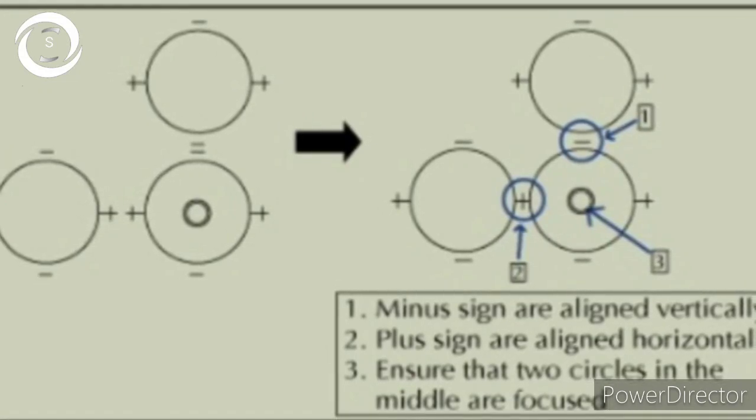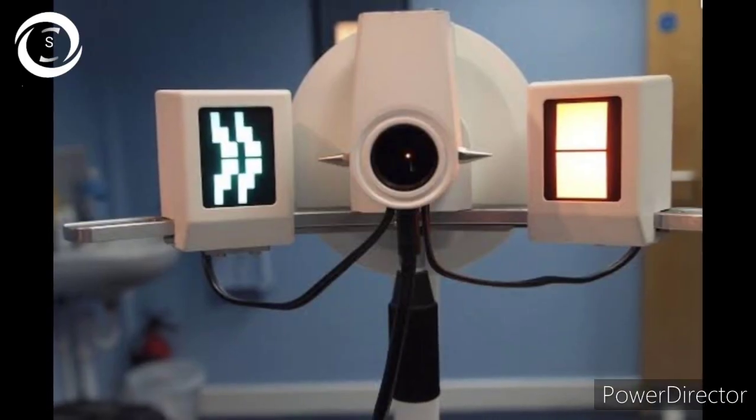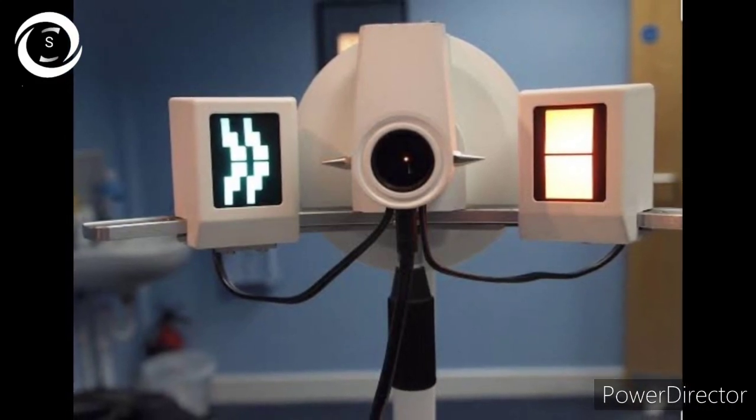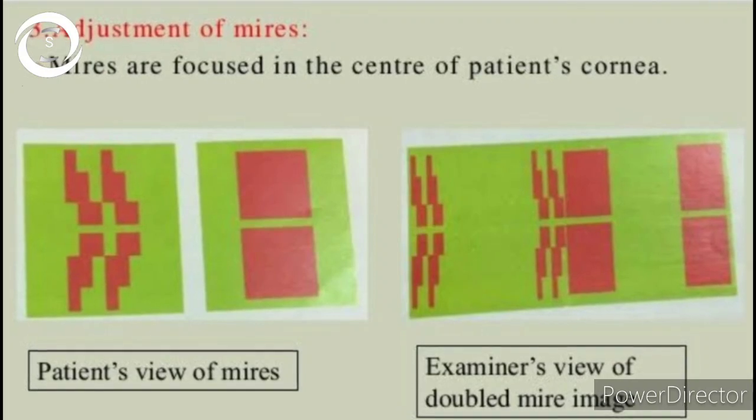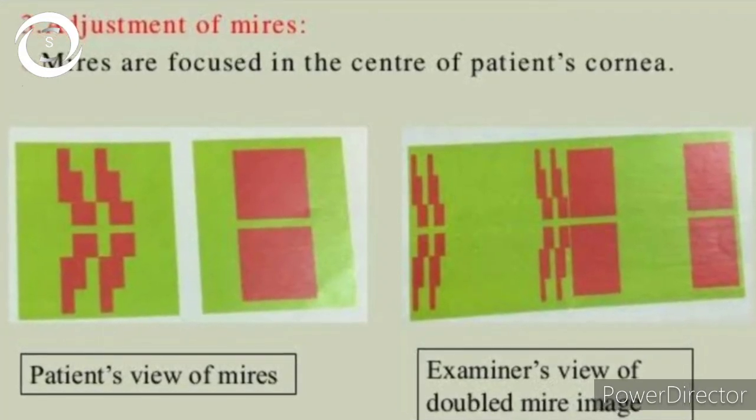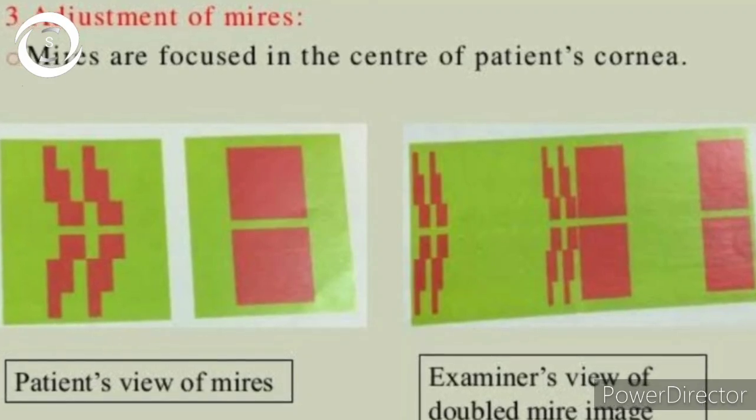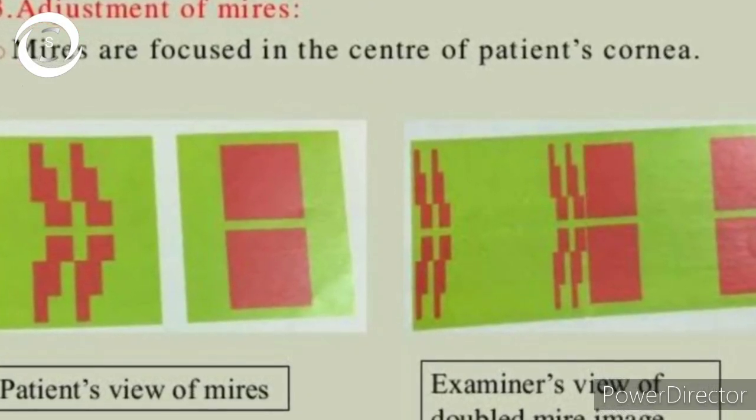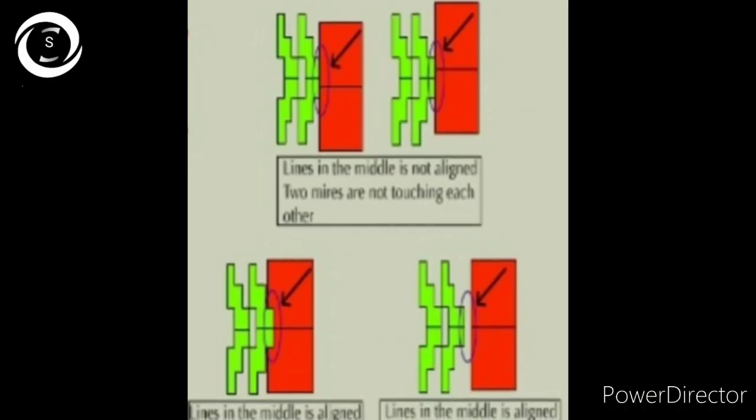Now comes the Javal-Schiotz keratometer. Mires are focused in the center of the patient's cornea. You can see the patient view and examiner view of the steps and the rectangle. You rotate the dial of the keratometer and the steps and rectangle are brought closer and should be focused.